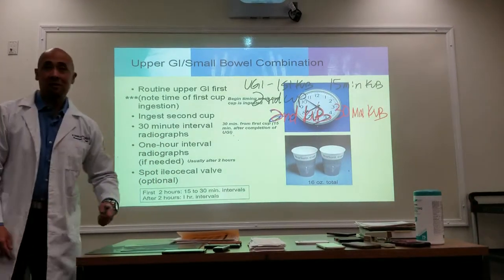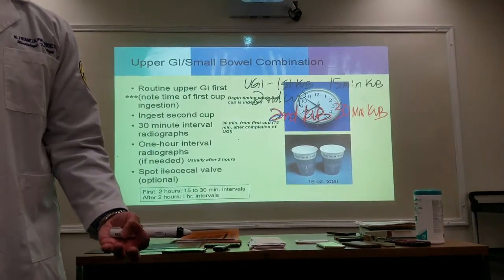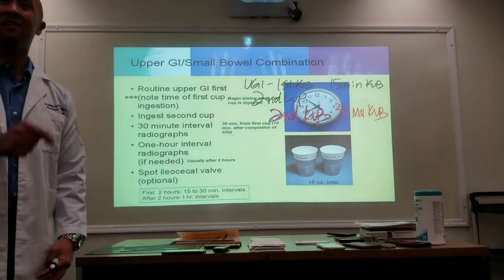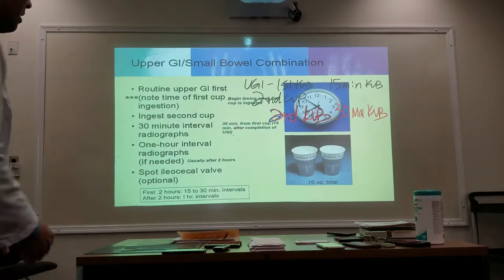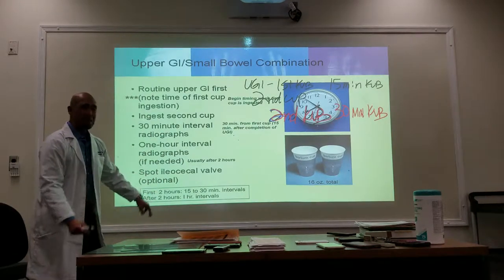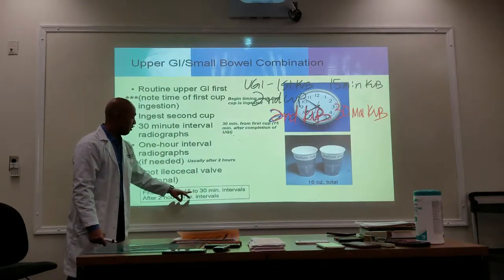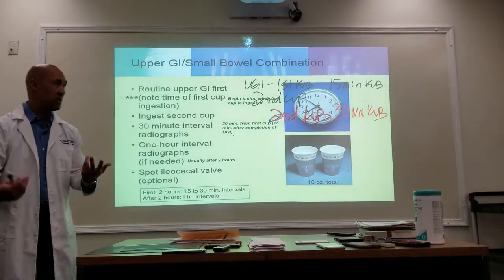When we do a small bowel series, all we're doing is taking KUBs. That's a small bowel series. Nothing special about it. They're just KUBs. The only difference is we do them in time sequences. So for the first couple of hours, depending on your facility, you either do them in 15-minute increments or 30-minute increments.